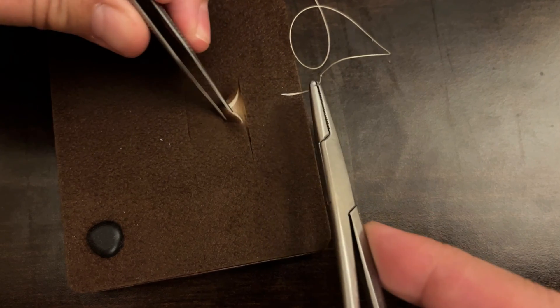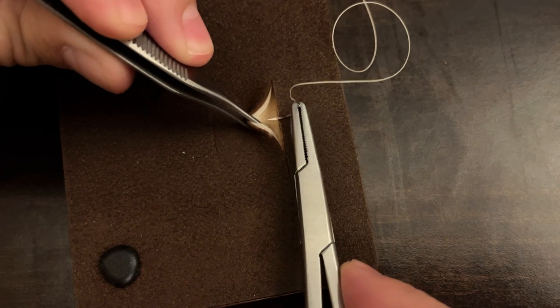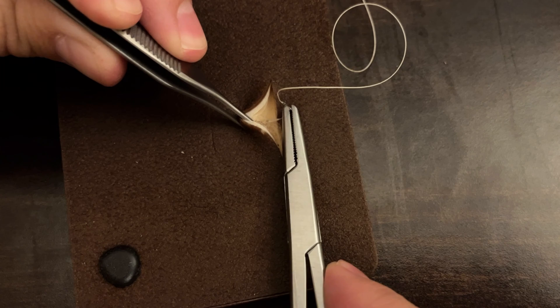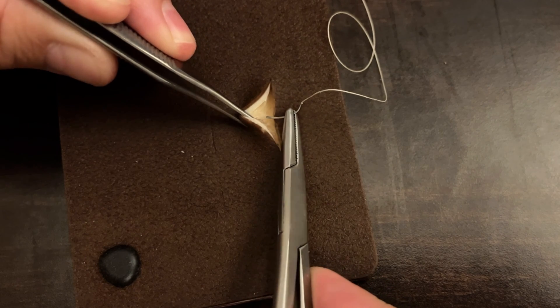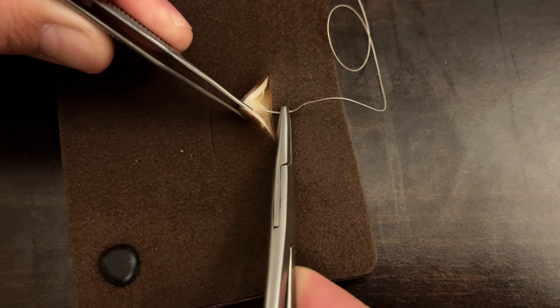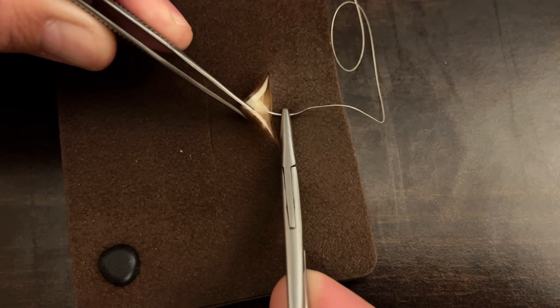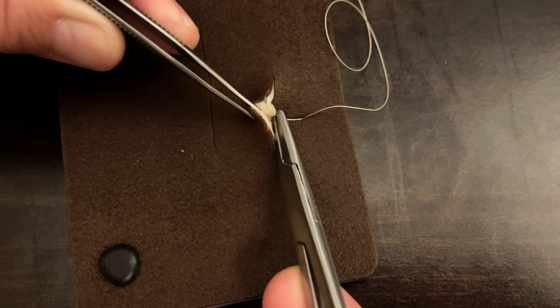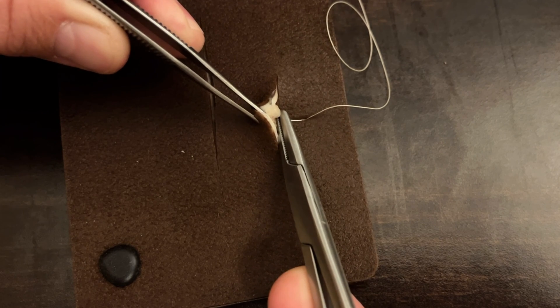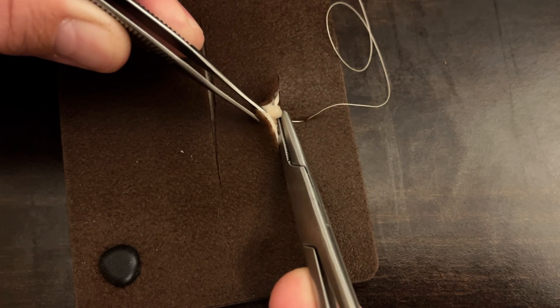With your pickups, go ahead and grab a hold of the skin so that you can see the subcutaneous fat and the dermis. We're going to start down in the subcutaneous fat, move through that tissue, and then pop up into the dermis — just deep to the epidermis. See how my needle has come up through the dermis but did not pierce the epidermis.